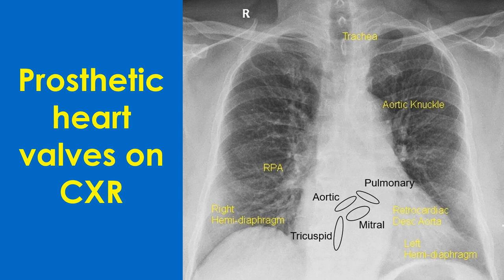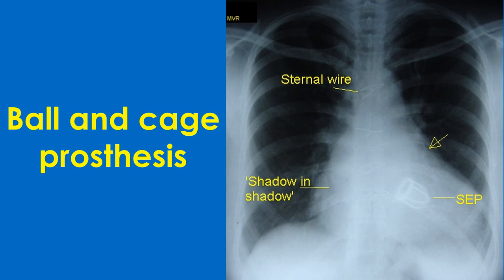The most commonly replaced valves are the mitral and aortic, tricuspid next, and pulmonary the least. Annuloplasty rings used for valve repair may also be seen on chest X-ray.